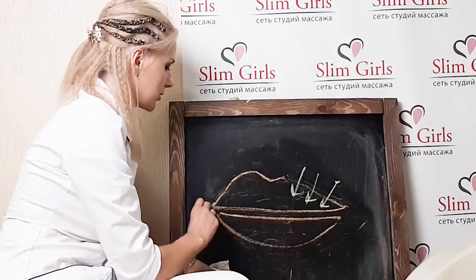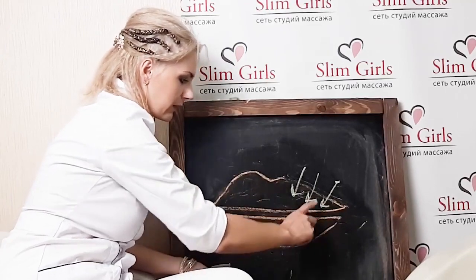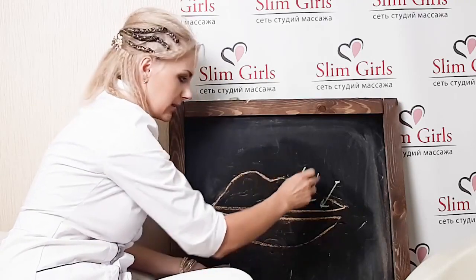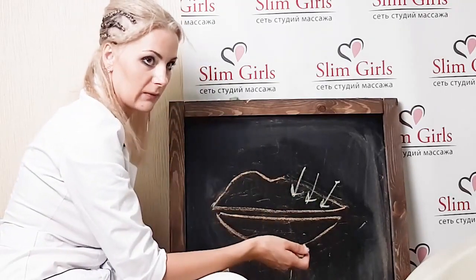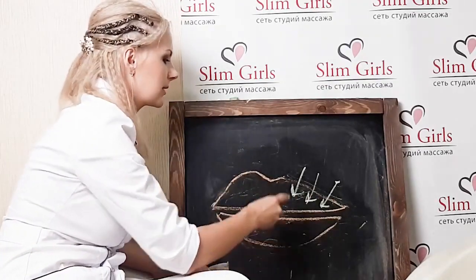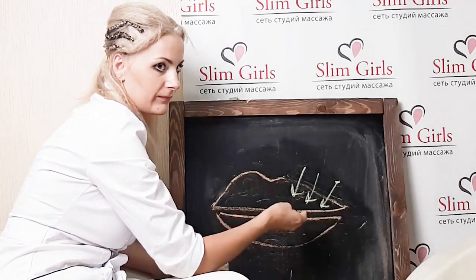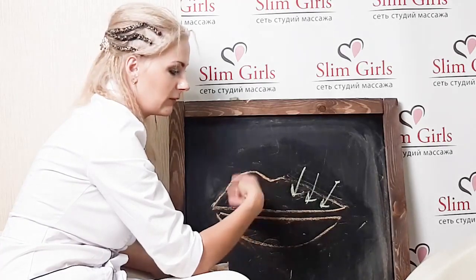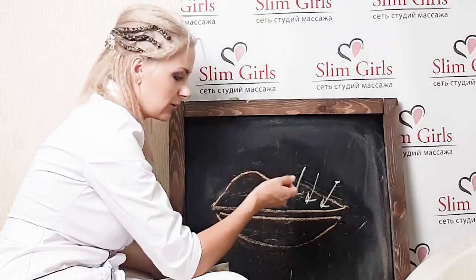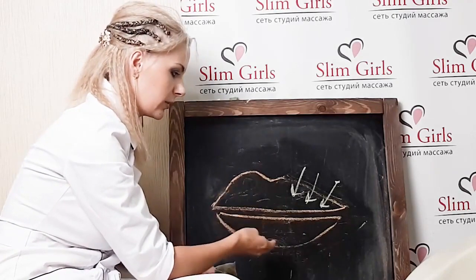Here we have to understand what we are doing, in principle, with this. First we go over the outline, zoom in on everything as usual, and then we do this. Or we do this first, see what happens, and then go through as usual. You have to realize that if there is a failure somewhere, an asymmetry, there is twice as much work there, either before the main job or after. But if you plan to do everything afterward and then eliminate asymmetry, then you have to calculate the preparation so that you have enough of it both above and below, and to eliminate the asymmetry.